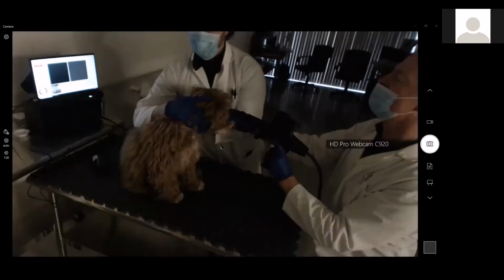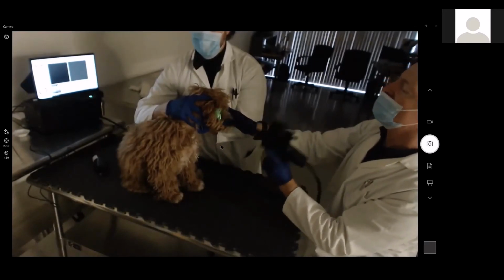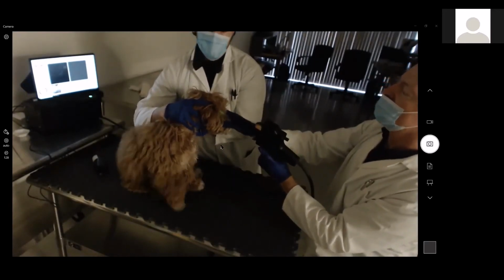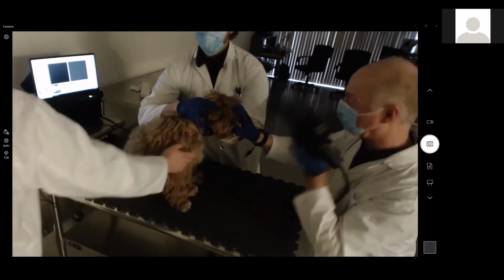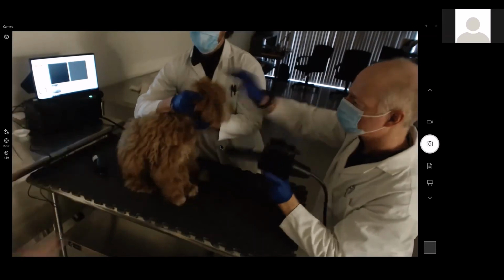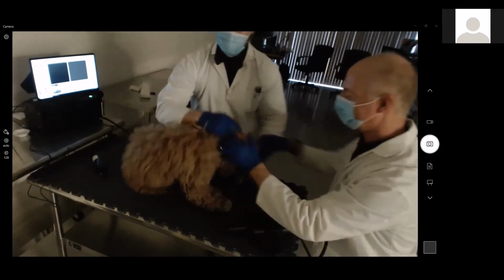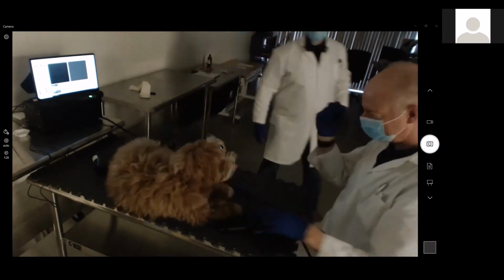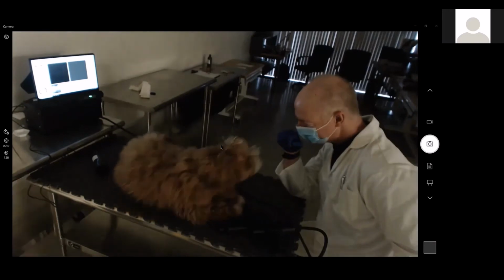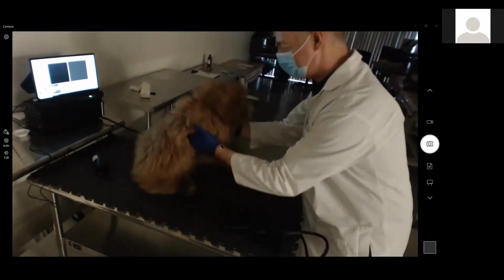All right, get ready for this. Come on, you're doing great. Best patient today. I need you to bring it back here. Okay, let's let him go for a second. All right, good boy. De-stress. Hey, I got something for you. Yeah, come up. Sit. Sit up.